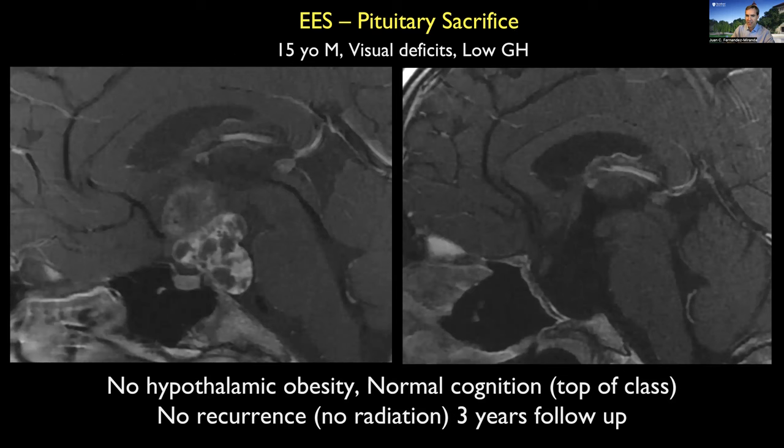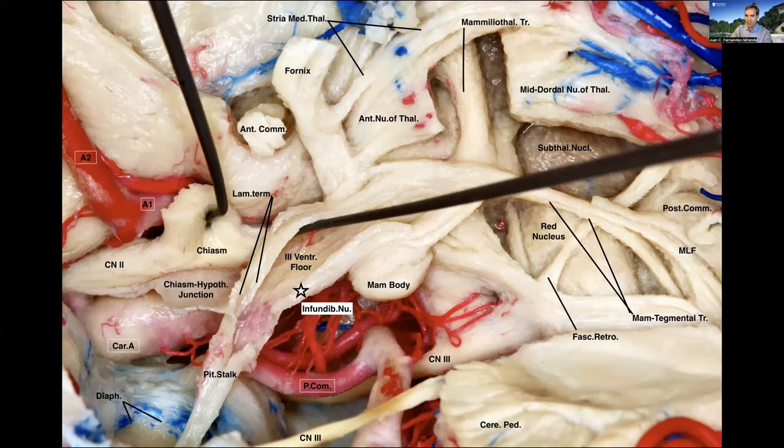How is it possible to do a good resection such as this one? Through the anatomy — through really understanding the anatomy well, and in particular the anatomy of the floor of the ventricle. The hypothalamic area is key to achieving a good resection in these cases, and I'm going to share this with you today.